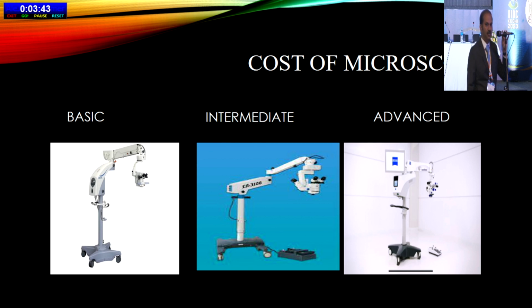So the question is, when you have a depth perception issue, do you want to switch off when you are doing the phaco emulsification? No. I would suggest that from end to end, you switch on and use it. That's the best part. As I said, with your neural adaptation, you'll get used to it. When you keep switching on and off, it is definitely going to be an issue. For example, at a rare instance, if you're going to have a PCR, it is going to be a difficult part for you. So right from end to end, you have to go with it.